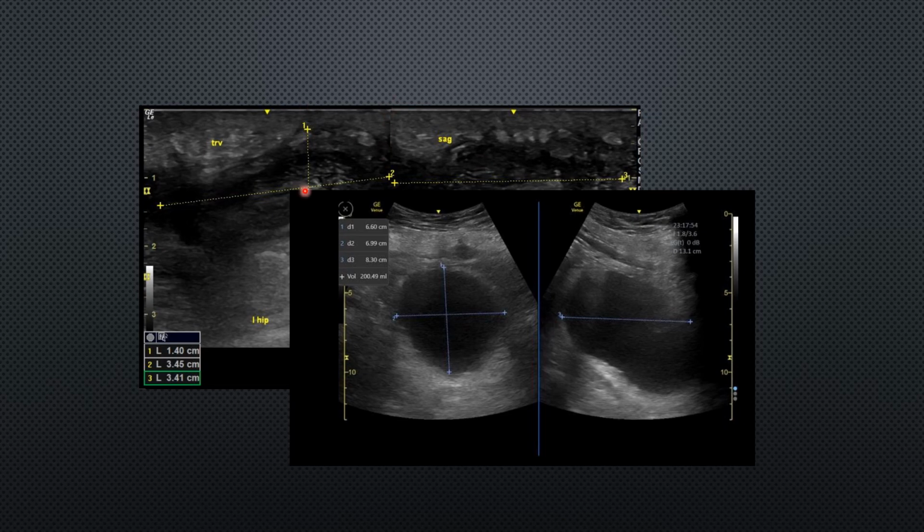So you notice on both of these, there's a plus sign here and a minus sign here, and then a plus sign here and a minus sign here. So if you keep that in mind every single time, you'll never get it wrong. A plus sign and a straight line doesn't really make sense, but a plus and a minus sign, that's what I want you to remember.